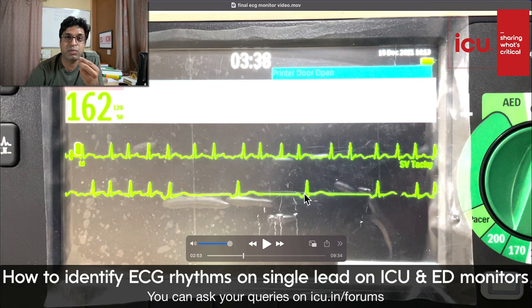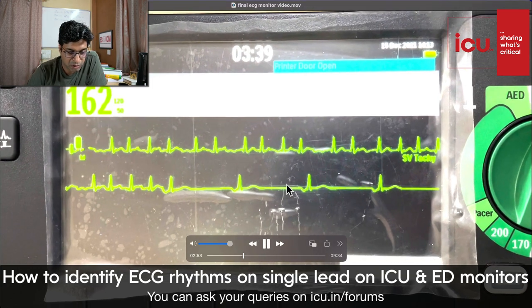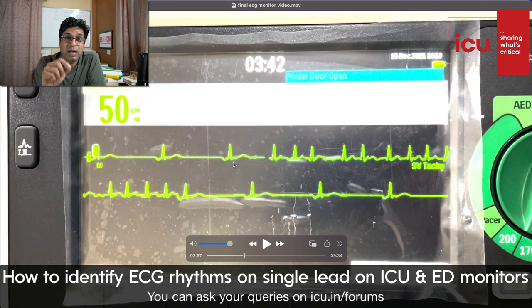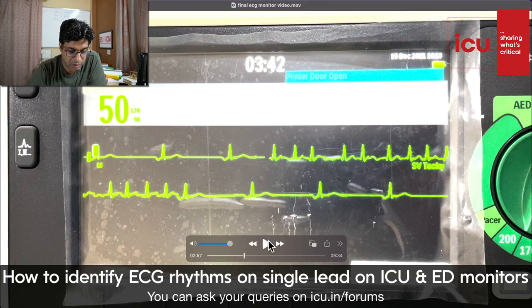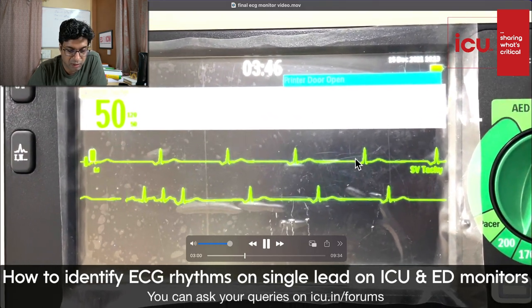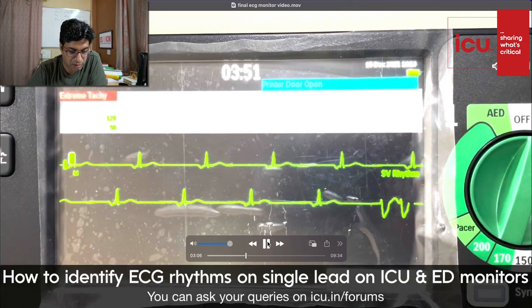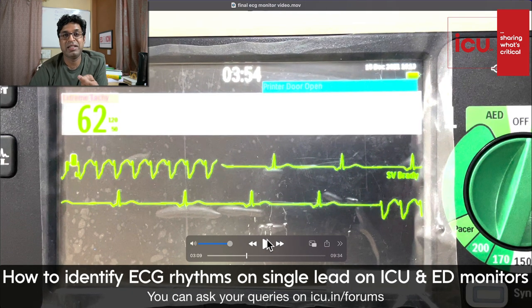At times in junctional rhythm you can see a P wave which is usually inverted, or you may not see a P wave, at times it gets buried in the QRS complex. So it's a junctional rhythm, and you must appreciate the junctional rhythm is not tachycardic, it's below 100. So it's just a junctional rhythm with inverted P. Still the junction. Now this nobody should miss.